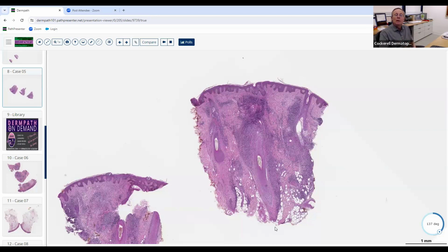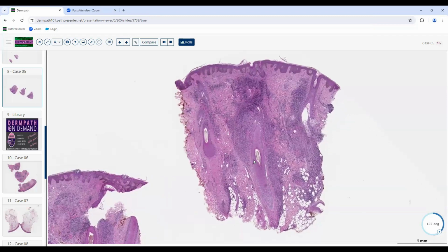Okay, good. So when we're dealing with alopecia histologically, we then ask ourselves, where's that inflammation located? What type of inflammation is it? You've already said it's lymphocytic. And then is this going to be a permanent alopecia with scar, or a non-permanent alopecia that could come back if you gave the person a JAK inhibitor or something like that? So what do you think here? You think this is more permanent? I think it's probably more permanent. Yeah, I totally agree with you.